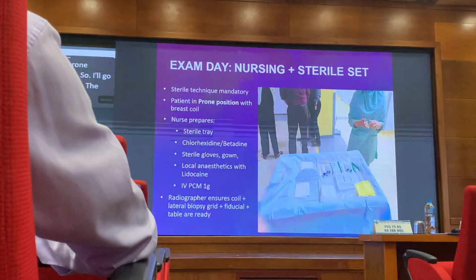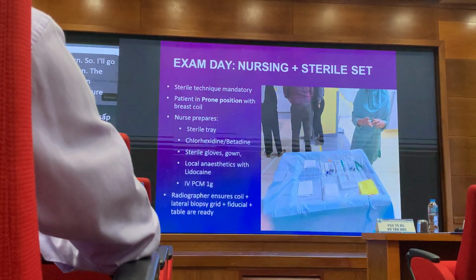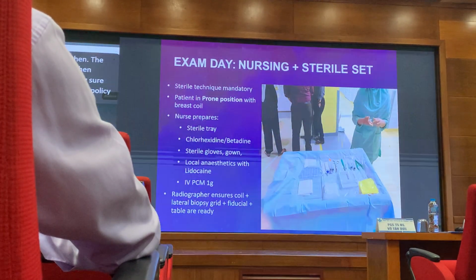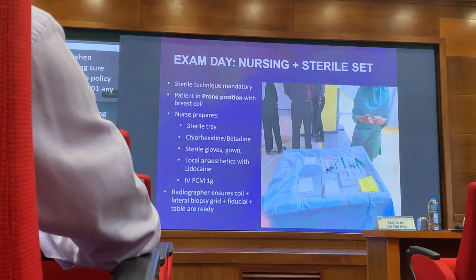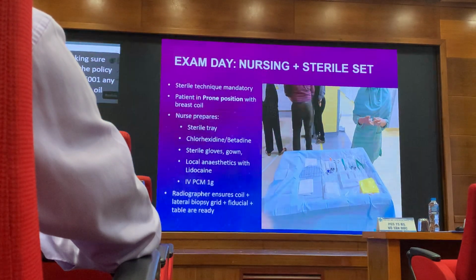And make sure everything, the coil, lateral grid, biopsy, and the fiducial that we're using is ready. Any oil-based tablet will do, because oil-based will be showing in T1 and T2 under MRI. And everything gets ready.